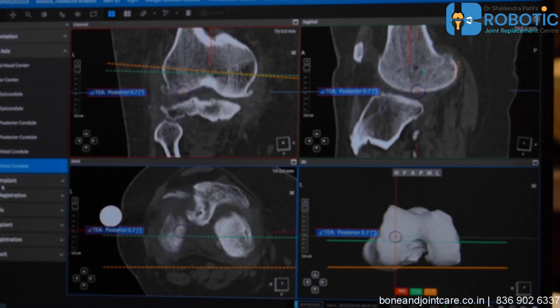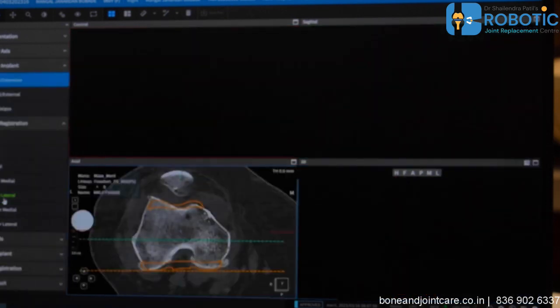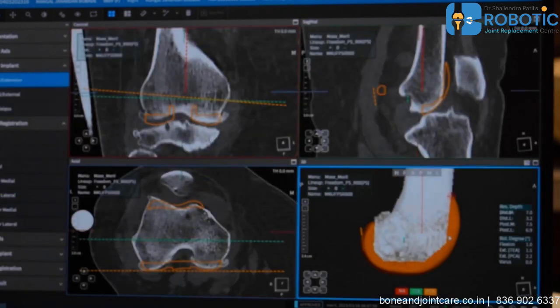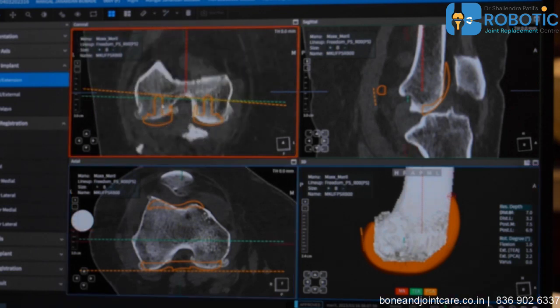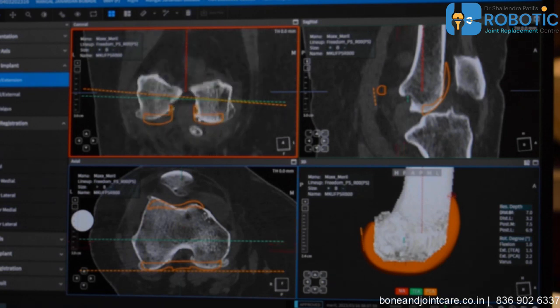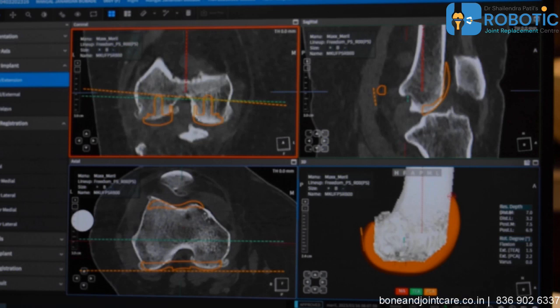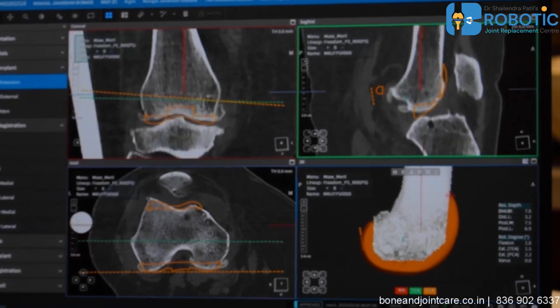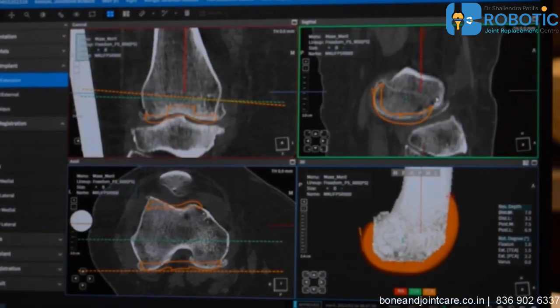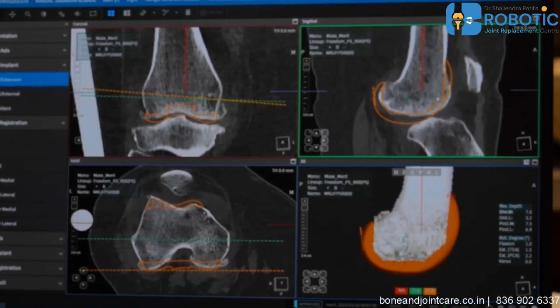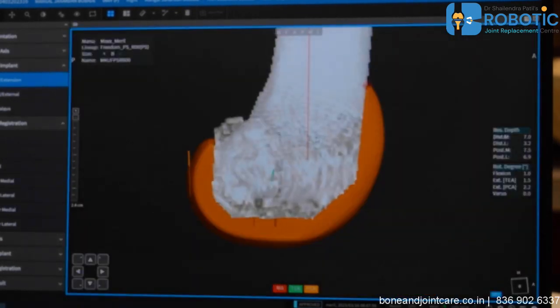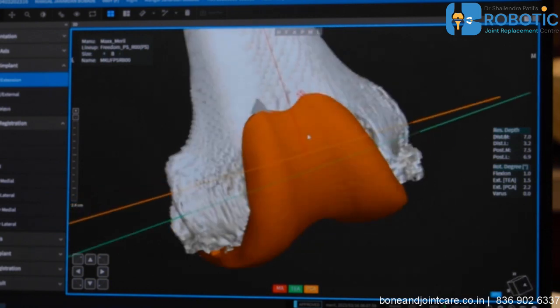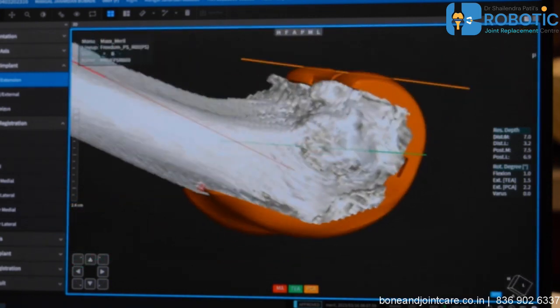Once these eight points are registered, the software gives an idea about the implant and its fit. You can see the colored margins — these are the margins of the implant — and how it is going to fit, right down to the last cut. You can enlarge every window and view from 360 degrees all around to check the implant fit.